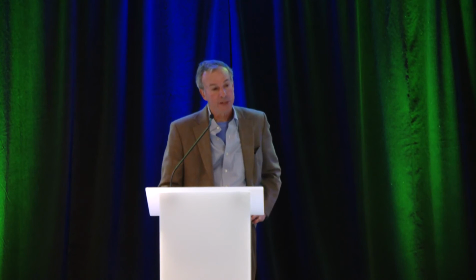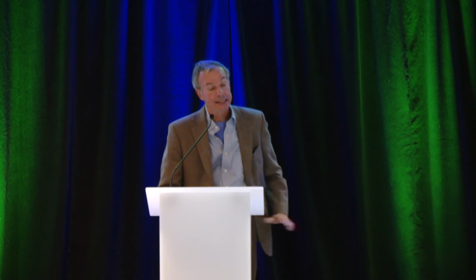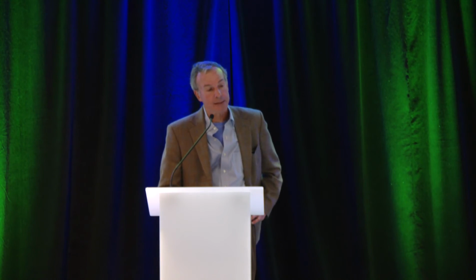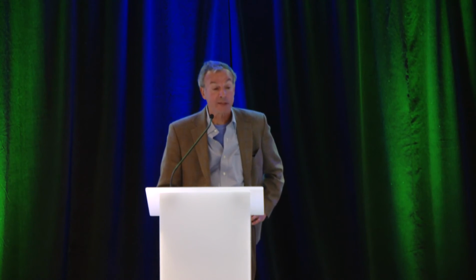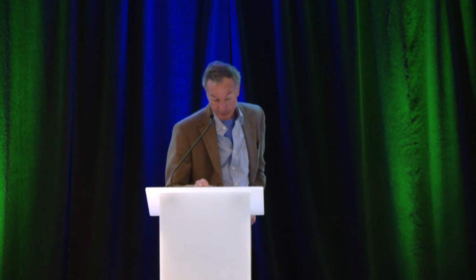So to summarize the history of manometry, basically first it was about temporal resolution, and that was the technology that evolved. Then it was about spatial resolution, and that's where we got into high resolution, closely spaced sensors, and finally it can be about radial pressure resolution, which is essential to understand asymmetric pressure zones such as the EGJ and the anorectal sphincter. Thank you.